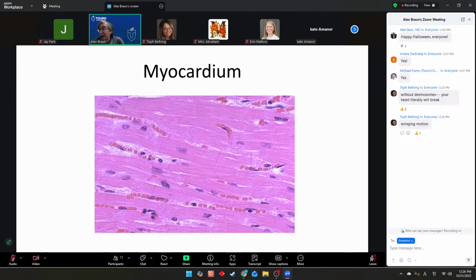Another feature that you might see in cardiac muscle is that the fibers are branching. And this, again, is something you need to look for because it's not always super obvious. But let me see if I could find something here. For example, here, this looks like a cardiac muscle fiber, and I think I see two branches here. So this would be a branch point perhaps right here where my arrow is, and then here's one branch coming off, and here's another branch coming off.